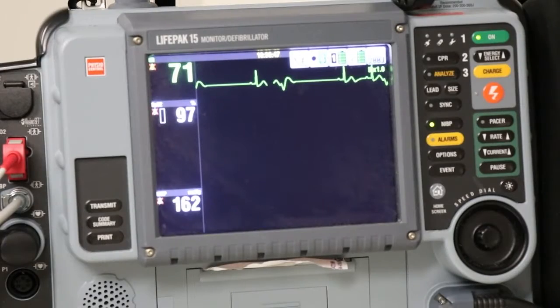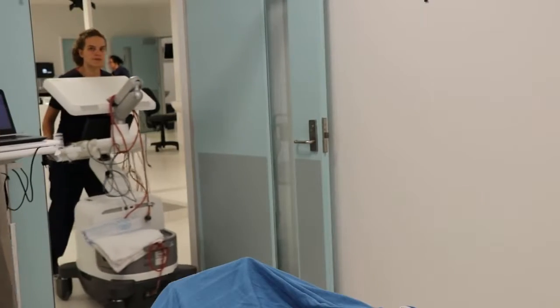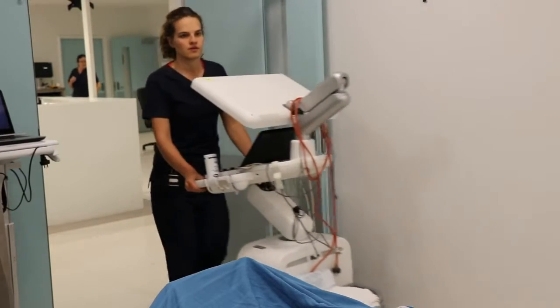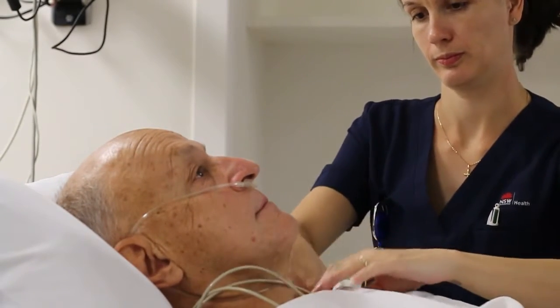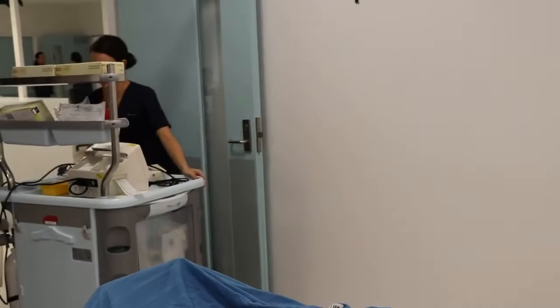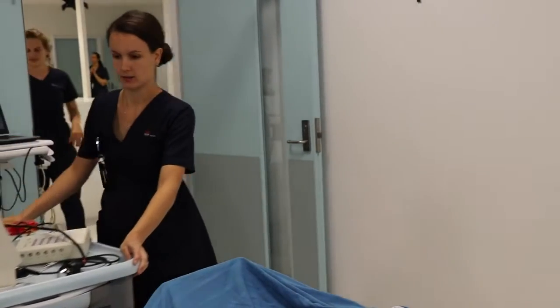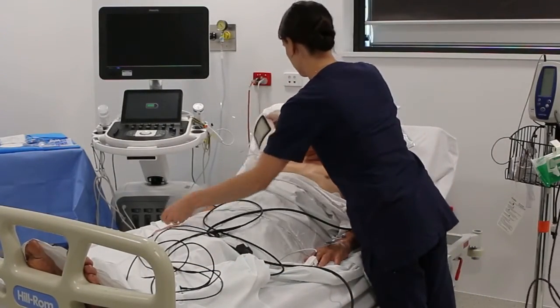The patient needs to have continuous cardiac monitoring in place and echo guidance for the procedure. This can be performed at the bedside within critical care areas, supported by advanced life support staff. The risk of further clinical deterioration is high, and prior to the procedure, you should ensure all resuscitation equipment is in immediate proximity, and the patient should have defibrillator pads on.